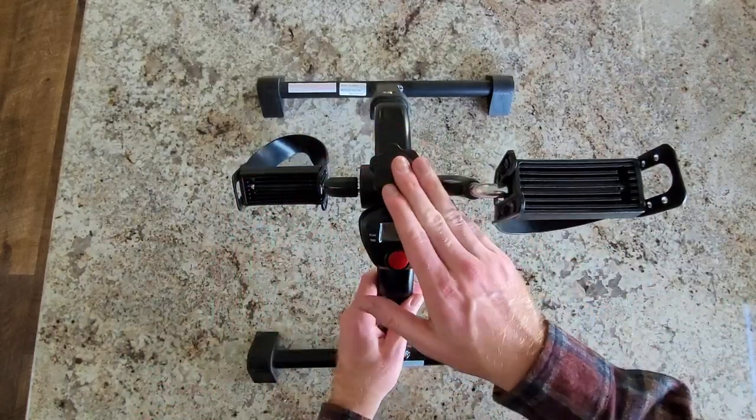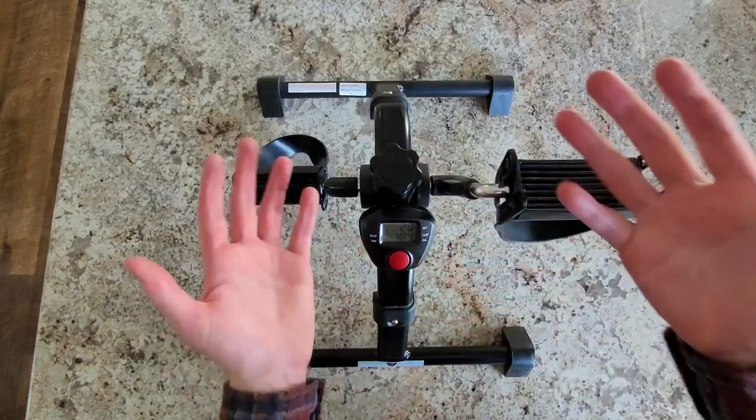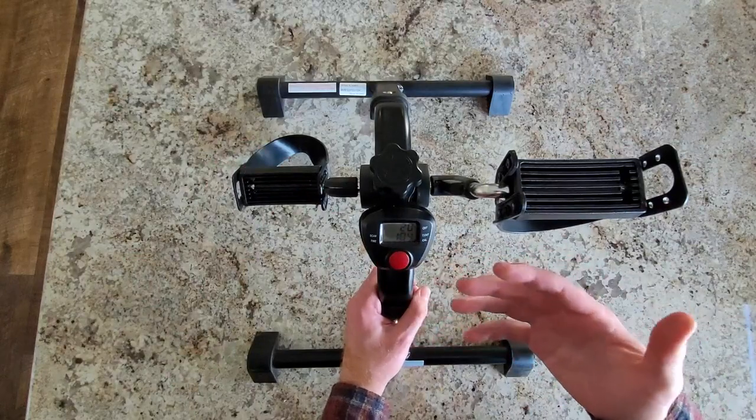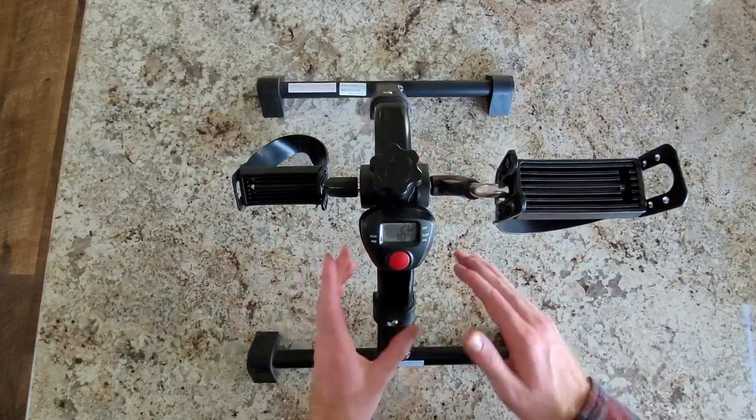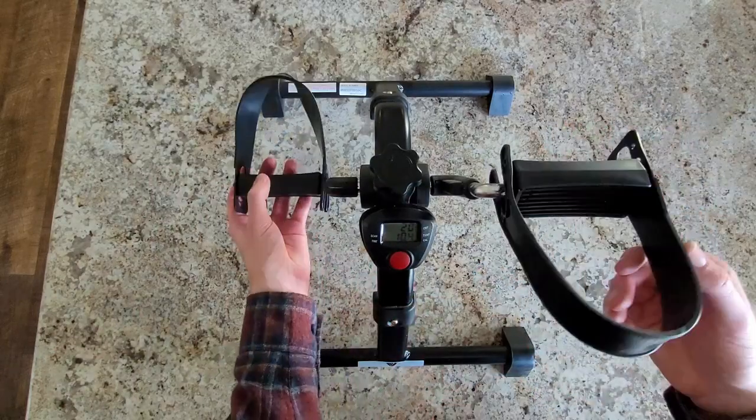Overall, I've been using this for over two years now. I keep count, it's fun, keeps me moving, makes me feel better throughout the day, burns the calories without me even noticing. And I've been very satisfied with this peddler. You and your body will love it. So there you have it for this peddler.